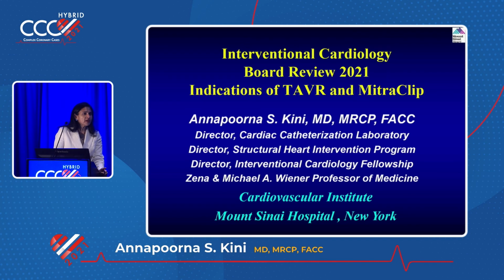And I don't know if you have seen, but yesterday when we did the LV gram, we used the JR catheter to get into the LV. So we never use pigtail. The so-called LV gram, we just do it by hand with 2 cc's through the JR catheter, not like a proper pigtail and Medrad injection, 40 cc dye. I don't think anybody does that because you have a nice echo. You don't want to expose anybody to a lot of dye.